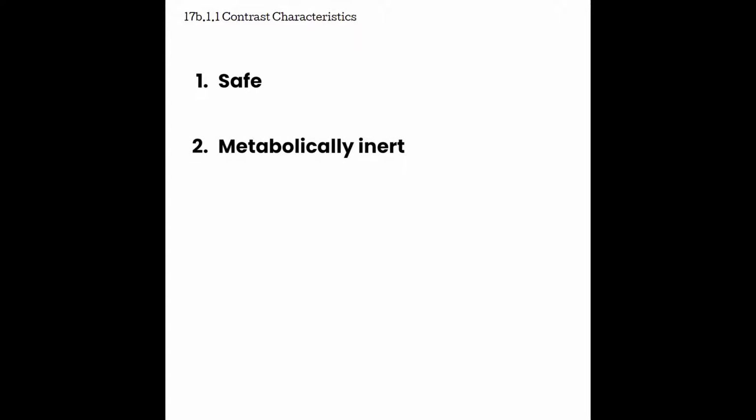Next, they need to be metabolically inert. Again, we don't want to be injecting things into people that are going to change things in their body. So we really just want it to be as simple as saline. It goes in, it dissolves, and nothing is left behind from it.